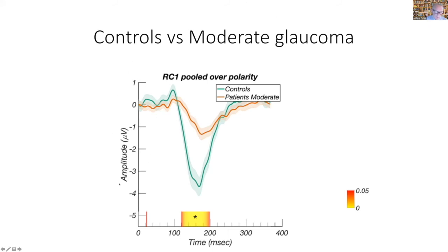So we're looking at voltage as a function of time. And right at time zero, there is a rapid change in the stimulus. That rapid change in the stimulus is what we're time locking the analysis to. And then we can average the data to improve its signal to noise ratio. So we'll see voltage as a function of time. Nothing happens for, say, 50, 60 milliseconds. And then that's the signal getting through the retina and up the optic nerve and into cortex. And then finally, cortex is able to receive this input and process it.